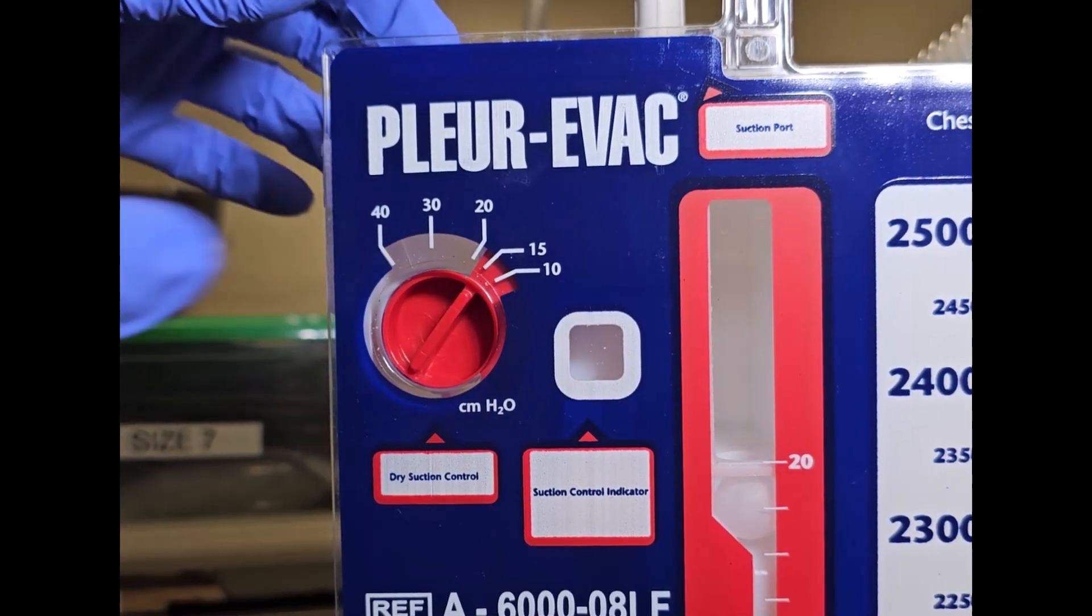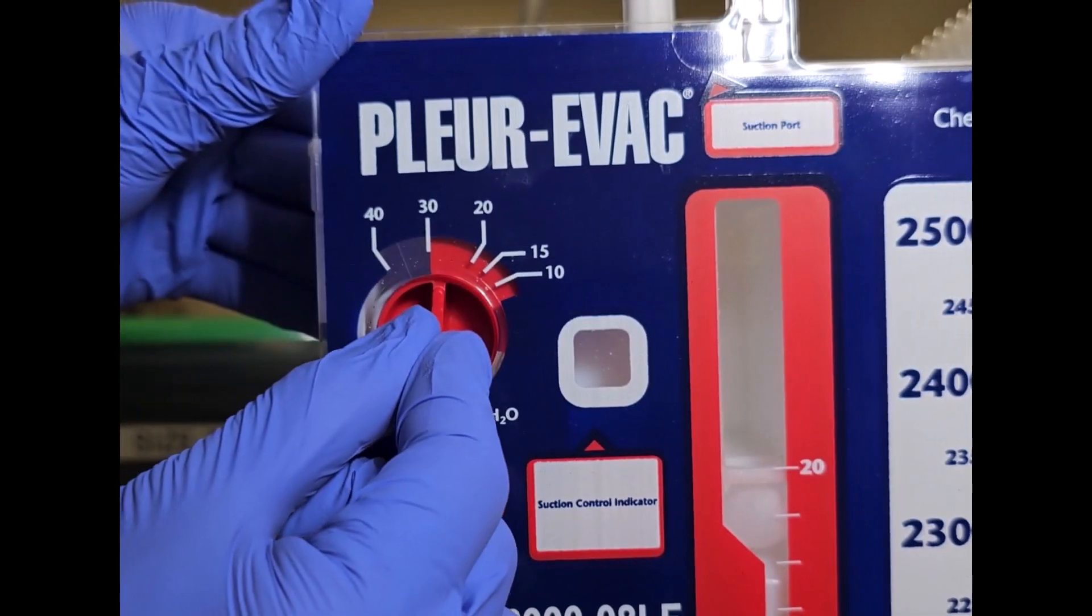You can adjust the ordered suction level by simply turning this dial on the front of the unit.